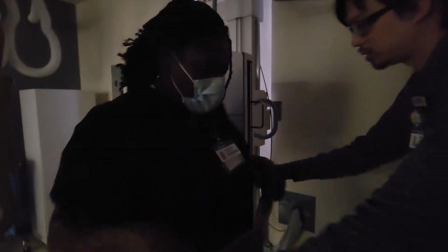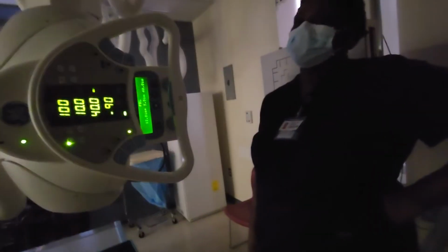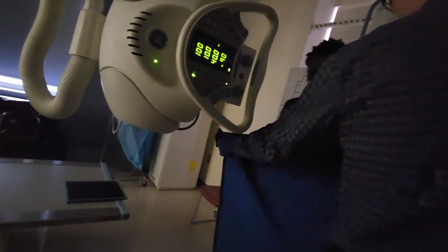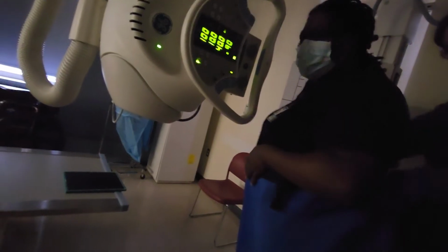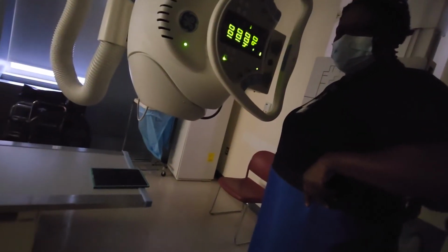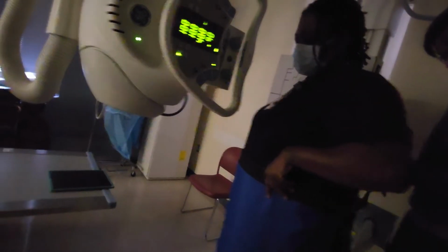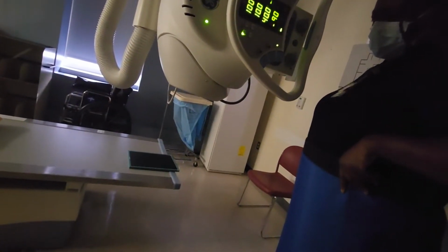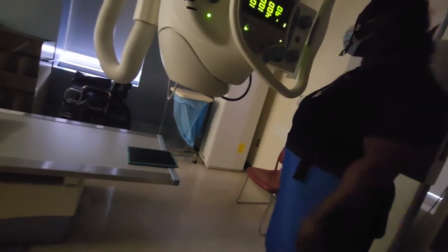If you hold this around the front, spin around, and I'll Velcro it in the back for you. This one? No? Just hold that around the front. There you go. You might need the extra large. Oh, all right, might need a big one. Yeah, this is kind of heavy. Hold on to that if you would, please. They're usually a little larger than that, but not that big. Hold on to the front. Yeah, that one looks like the ones that we wear in actual clinic. All right, great.